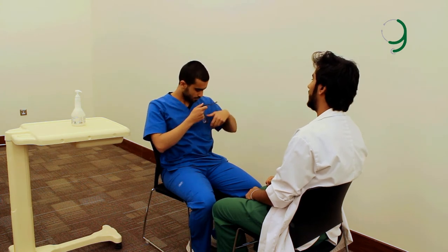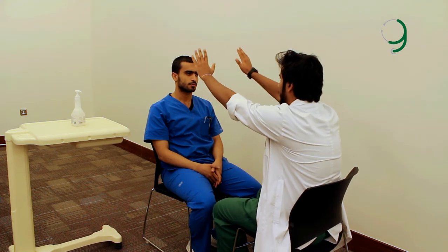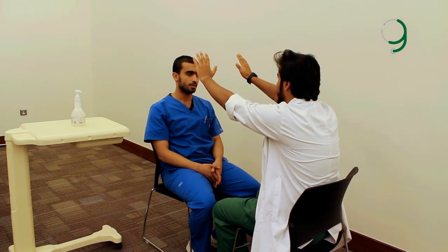Next is the visual field assessment by confrontation. First, you have to ensure an optimal seating position — your eye level must be the same, and the distance between you and the patient must be at least one to two meters. You can use your knees as a guide for a good seating position. Second, ask the patient to take off his glasses because the rims might obscure the visual field. To begin, assess gross visual defects. Ask the patient to focus on your nose and ask him if any part of your face is missing. Is any part of my face missing? No. Alternatively, you can hold up two hands. Do you see two of my hands? Yes. Do they appear normal? Yes.